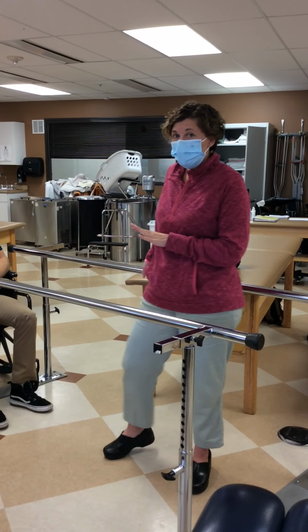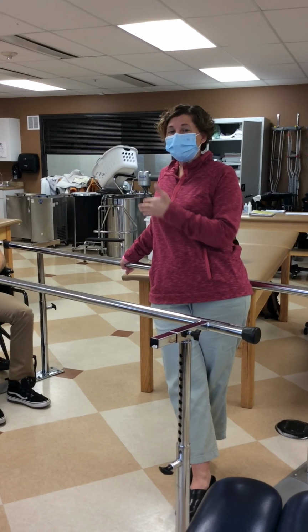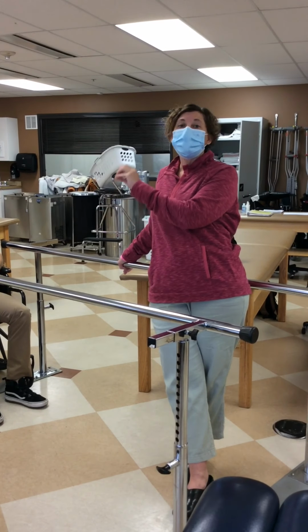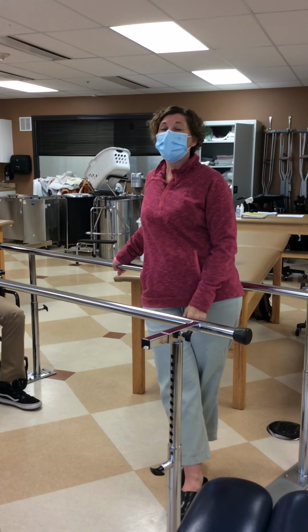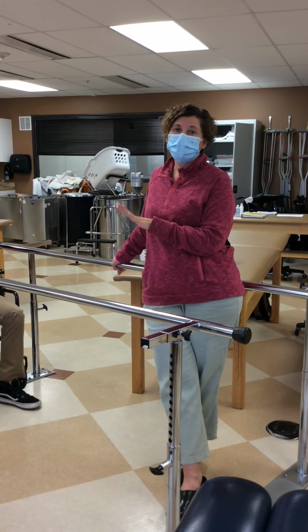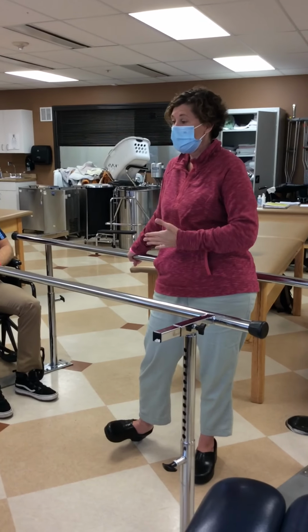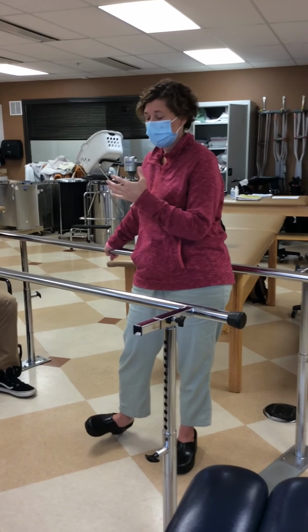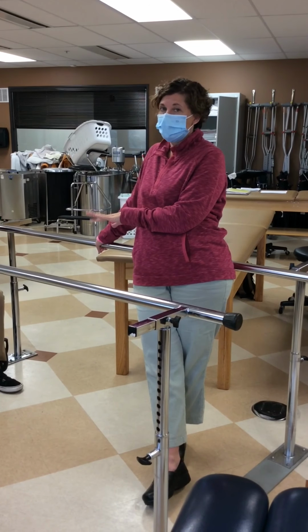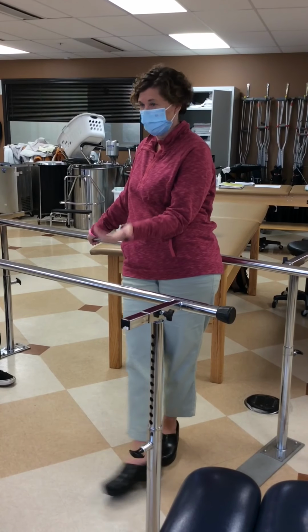So if we're starting gait training, we're going to do several different videos of gait. The first one will be gait in parallel bars, and then we'll have gait with a front wheel walker, gait with a hemi walker, and maybe gait with a quad cane. So we'll go from parallel bars into gait with less restrictive assistive devices. All right, so what we have done is all the transfer training. We have started gait. So you'll see that anytime I start gait with somebody, I want to do some level of pre-gait just to prep the patient for success.